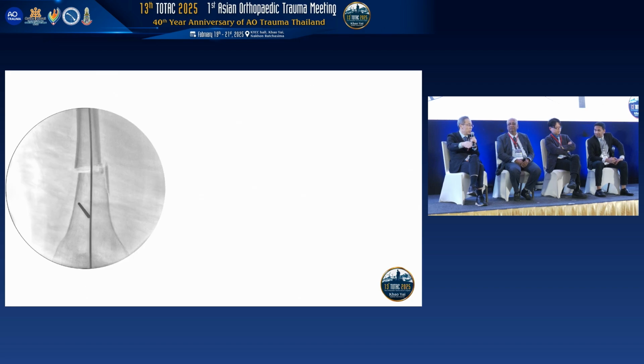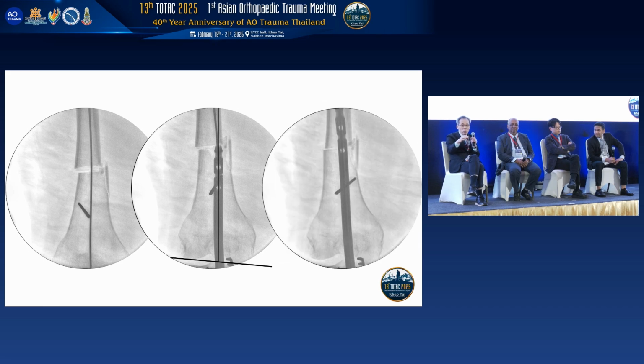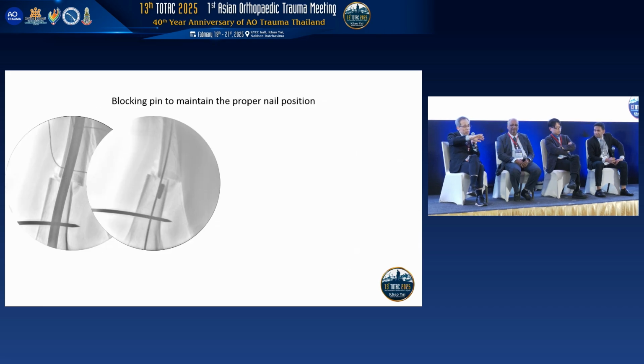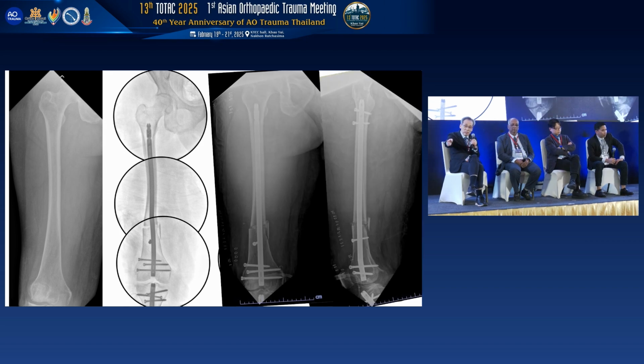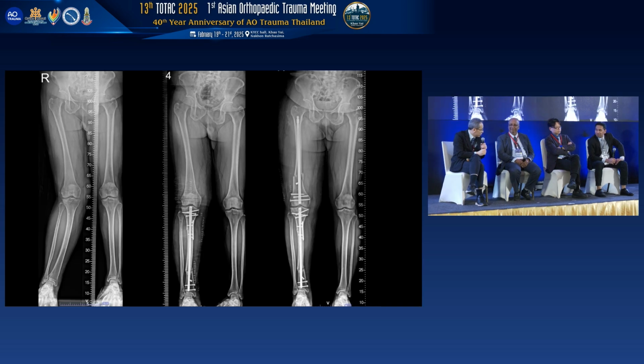We know that we do not have to close the wedge fragment on a femur shaft fracture or whatever area. So for me, it may be better to have a dome osteotomy. It may correct a lot, even translation. So it's another way. Anyway, the femur is very nice, and now I'm very satisfied with this.